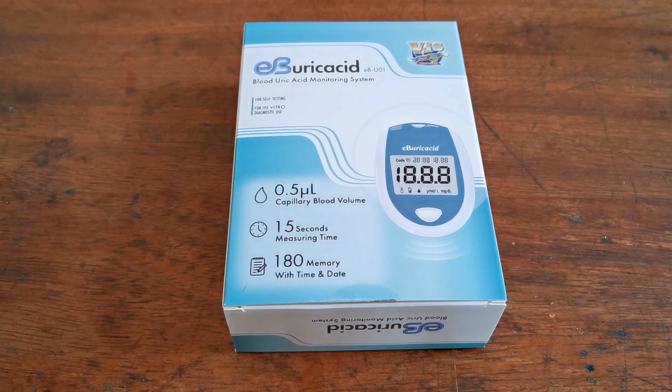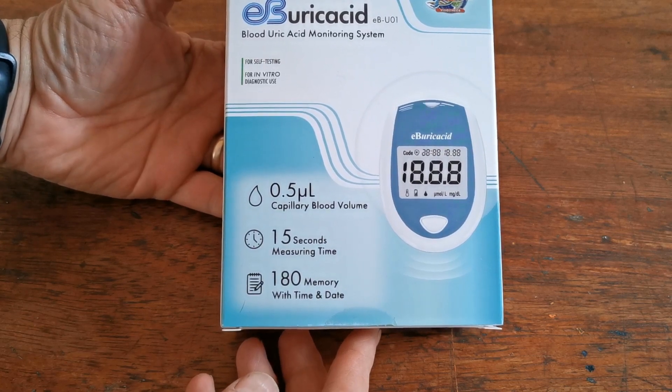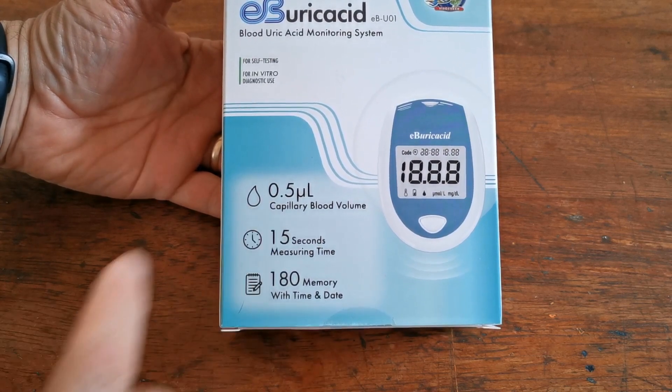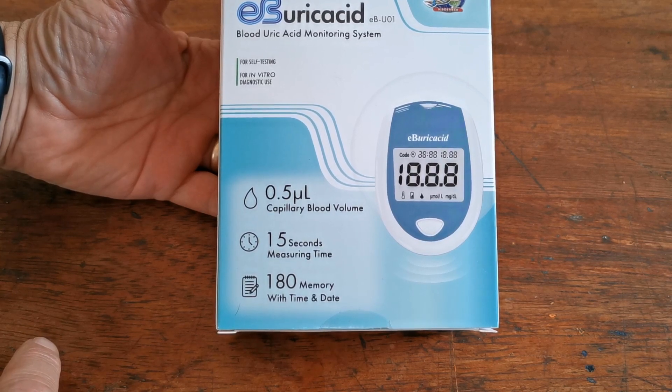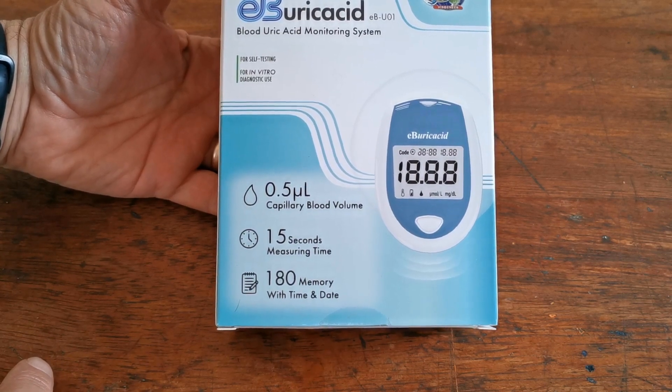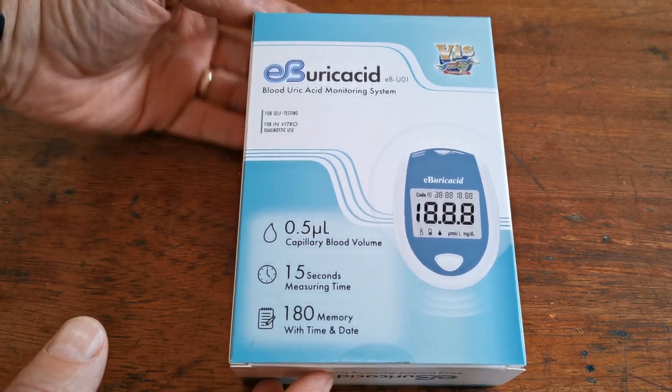Welcome to this Valumed product demonstration video for the EB-Uric Acid Dedicated Blood Uric Acid Monitoring System. It requires only 0.5 of a microlitre of capillary blood to trigger a test. It takes 15 seconds to run a test analysis and holds 150 test memories.